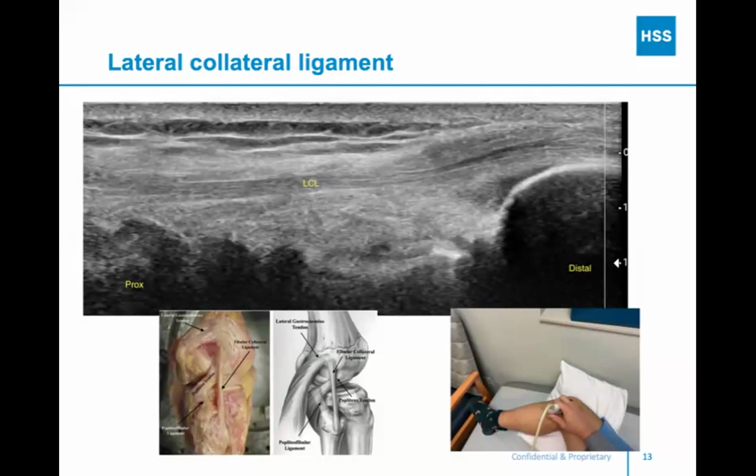And then we definitely see those abutting the meniscus. If you see a cyst on the lateral knee and you don't see anything abutting the meniscus, you should definitely have a high index of suspicion that this might not be a parameniscal cyst. And then you have to go down your cystic slash soft tissue mass differential diagnosis and scanning and things like that. But yeah, I know there was a lot of things there, but overall, I think you did a great job with this presentation.